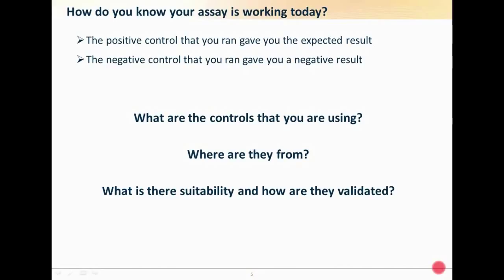And likewise, with positive control for molecular assay, it's often a short primer that is always easy to amplify. For FISH or IHC, occasionally the positive control can be so overexpressed, or such high copy number that any probe will work for it, and again isn't patient relevant or patient suitable.